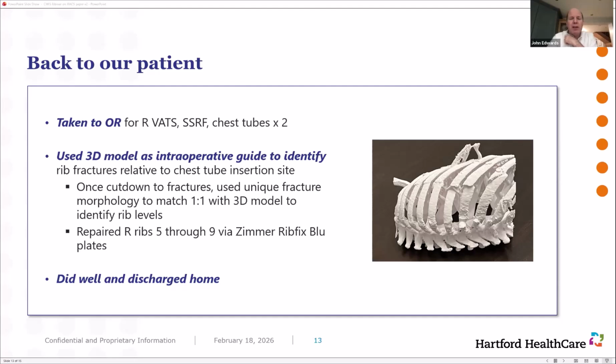take a CT scan, plan from the opposite side and invert it, work out which plates you need, and then you press a button and out at the bottom come a number of plates, like a machine at the fun fair, and you just sterilize those, take them to the OR, and you don't have to do any intraoperative plate contouring at all. That's a dream. Whether that'll ever happen, I've no idea, but it sounds like an interesting thing to me.